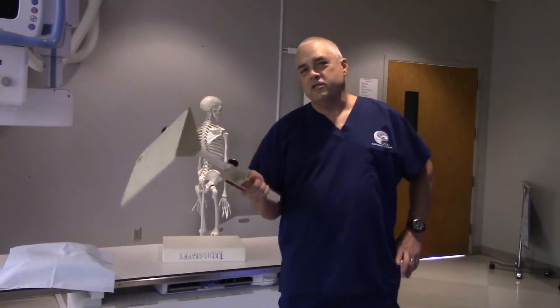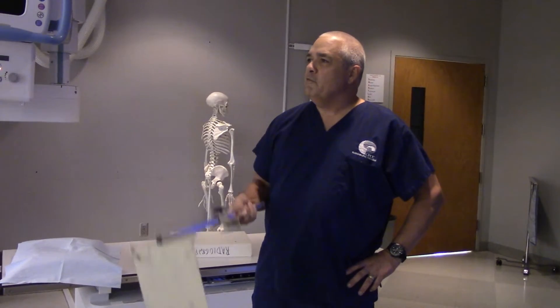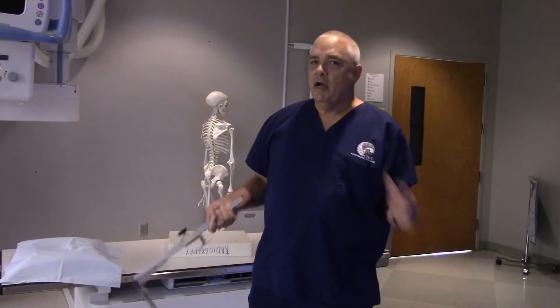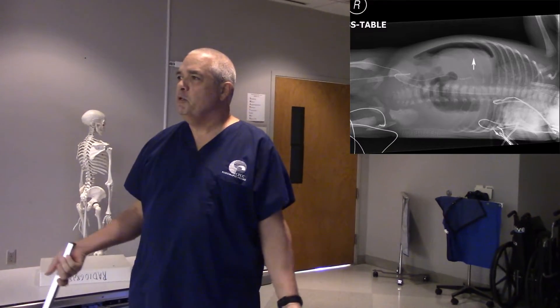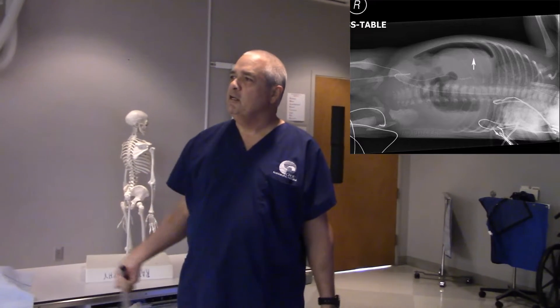So as we were discussing, and Delaney had just mentioned, we always do left side down, abdomen. How come? Because we want to look at something. We're supposed to be looking at something. What do you think?